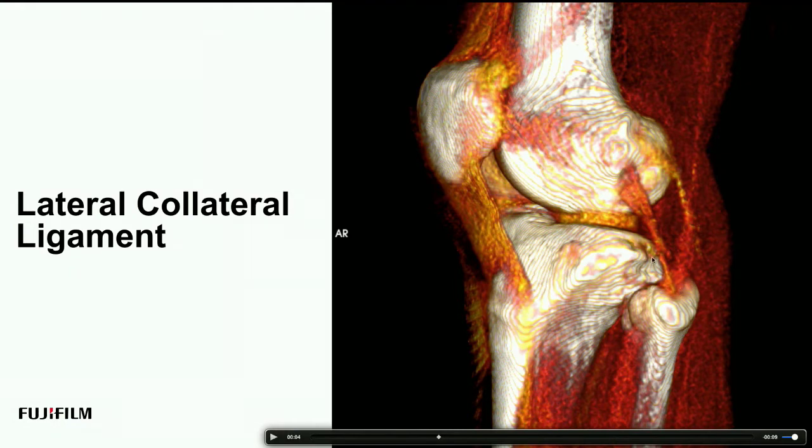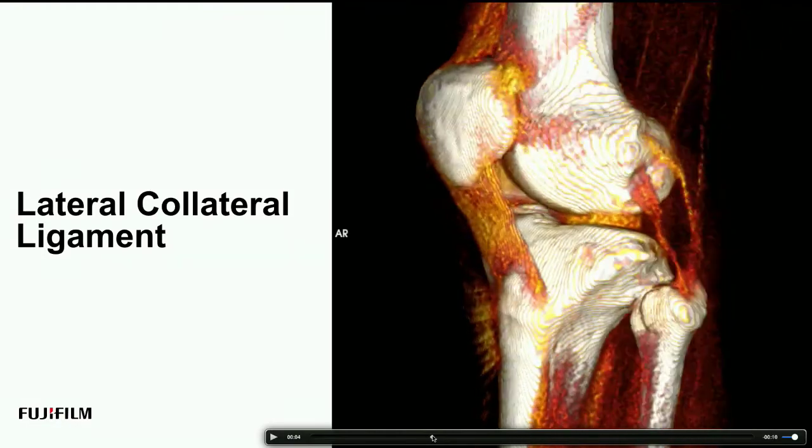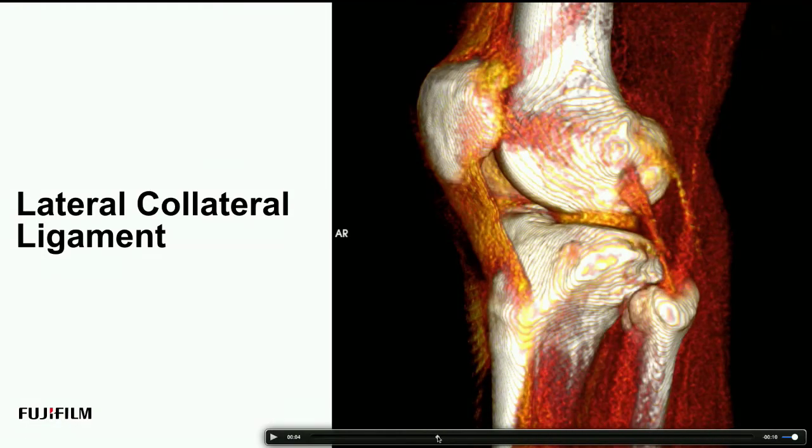And then sharing an insertion, which we're going to talk about also, is the biceps femoris. They do overlap and interdigitate a bit here on the fibular head. And we're going to be scanning that live, even though we're not going to be discussing it completely diagnostically here. So landmark wise, looking for that joint line.